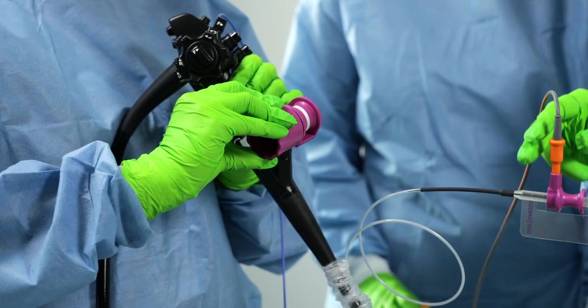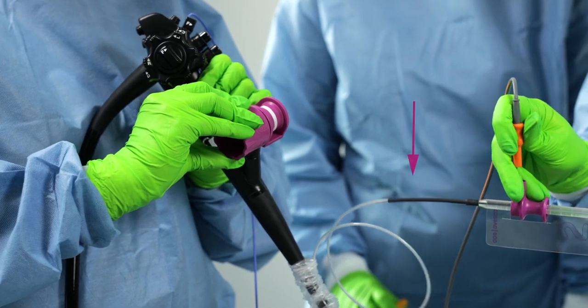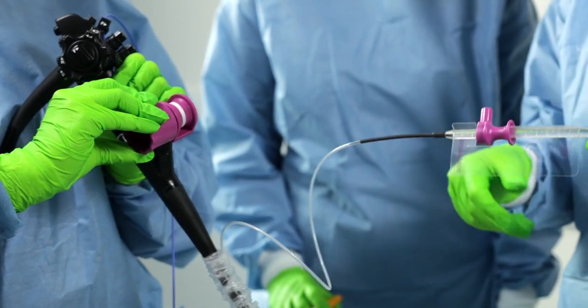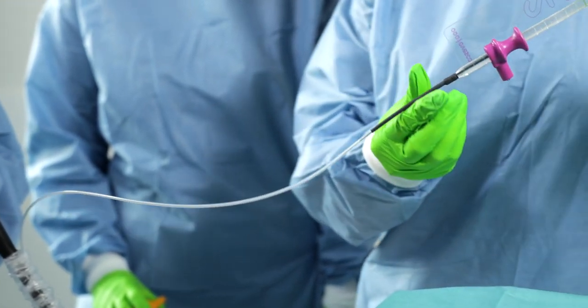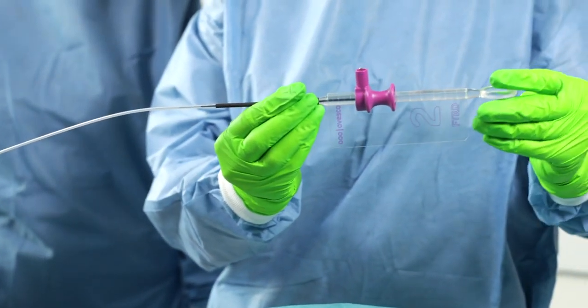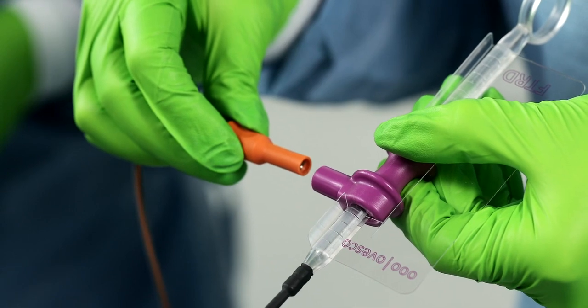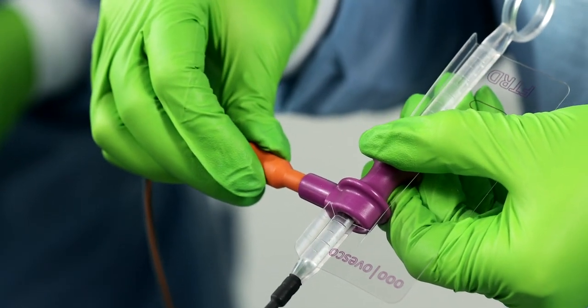The part of the snare shaft that is not inserted, especially the black-bordered area above the handle, must be as straight as possible and not kinked or coiled. Otherwise, this can make snare closure difficult or even impossible.